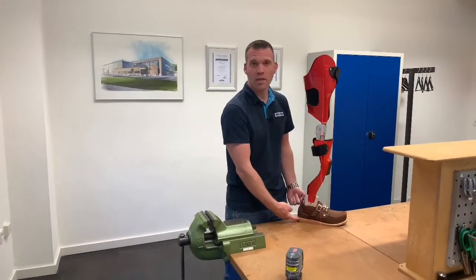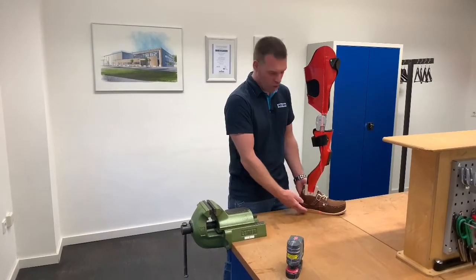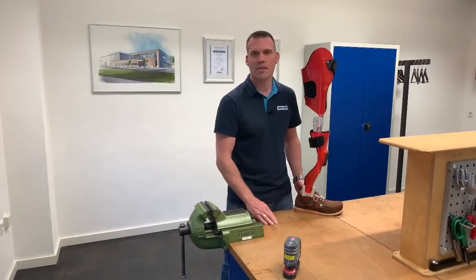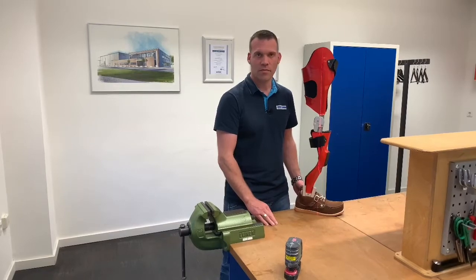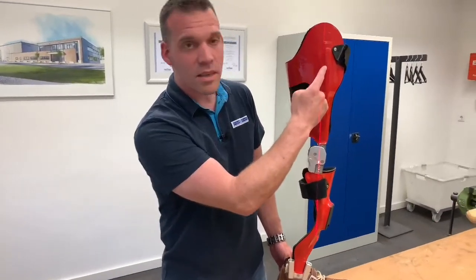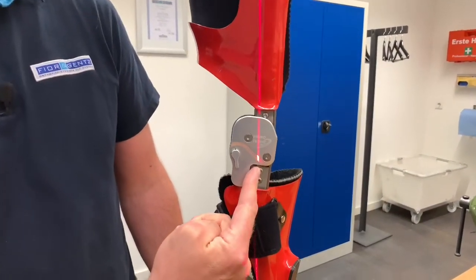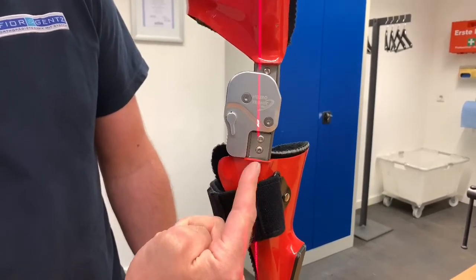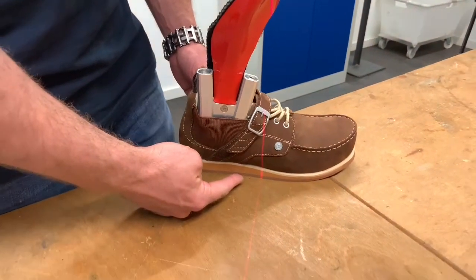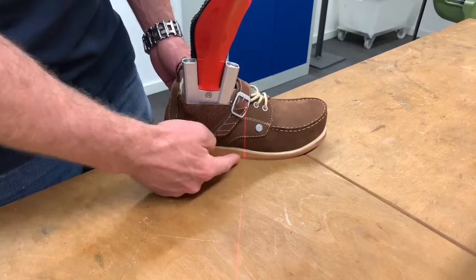Together with the shoe that the patient will wear afterwards, to ensure that the correct heel height is taken into account — ideally with a self-adjusting laser plumbet. The plumb line should fall through the middle of the thigh, in front of the mechanical axis of the knee joint, in front of the ankle joint, and — pay attention, this is very important — in the posterior third of the front half of the supporting surface.